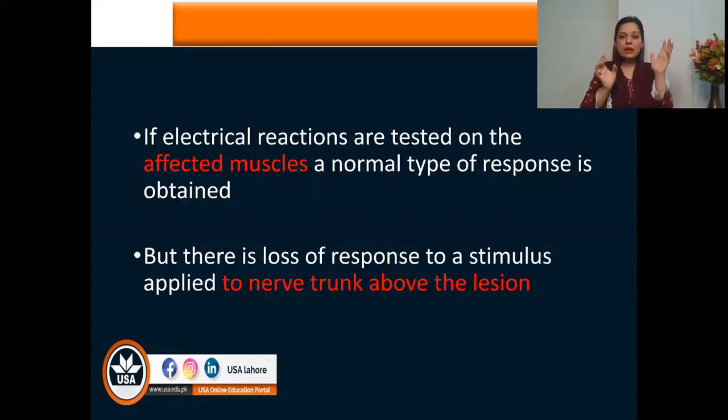So this gives an idea that when I stimulate at this level, the message is not going to convey to the hand, to the fingers, but when I directly stimulate certain muscles, they are going to convey the message. It means there is some lesion, and we can assess it by checking at this level. After crossing this level, we may find that the message is conveyed. It means there is some issue at this level, which gives you an idea about the site of the lesion. And it also gives you an idea about the extent of the lesion, whether the response is present, diminished, or markedly low.